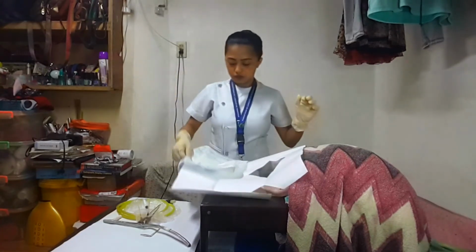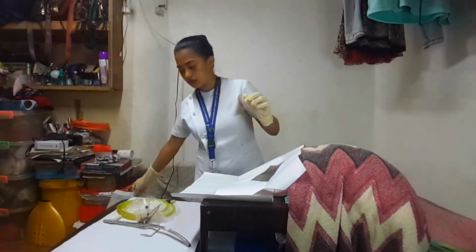Okay. So as I have mentioned, we have to place it in one place.